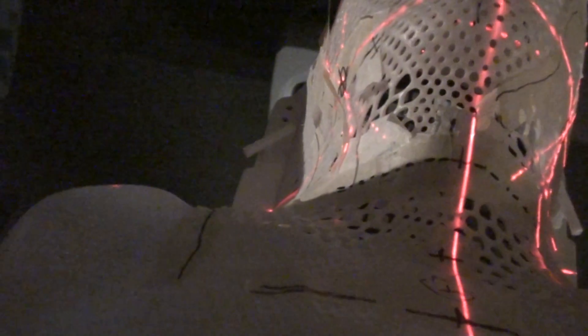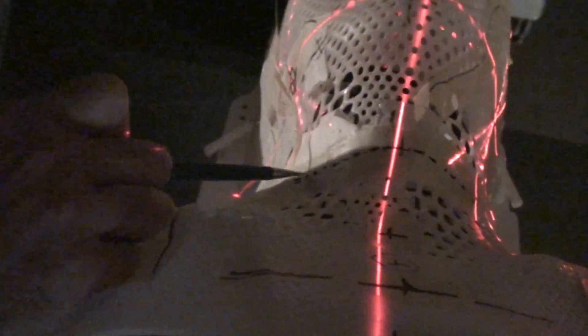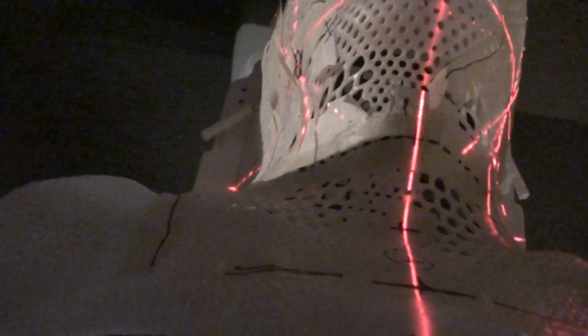You have to remember that whenever you go to the opposite lateral, you have to mirror your table. I'm going to mirror my table right now to show you how off it can look. You can see that we're matching at the anterior aspect but not at the inferior aspect. We've actually going to end up with a cold spot right here if we don't have the table kicked correctly. Table with the feet kicked toward the gantry causes our inferior divergence to match the anterior non-diverging beam.